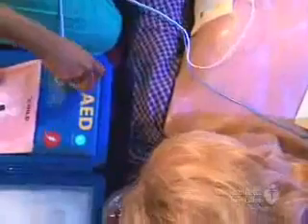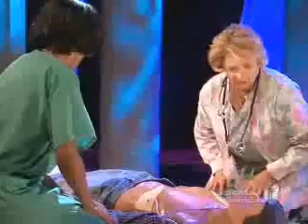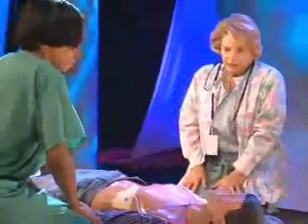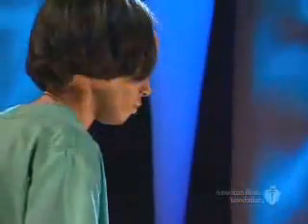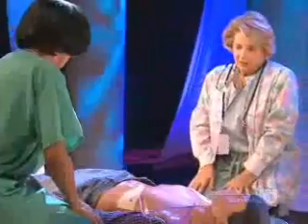Plug in the pads connector next to the flashing light. The AED is now ready to check the victim's heart rhythm. Most AEDs begin to check the rhythm as soon as the pads are attached and connected. For others, you press an analyze button. Analyzing heart rhythm. If the AED detects a rhythm that could be treated with a shock, the AED will tell you so.